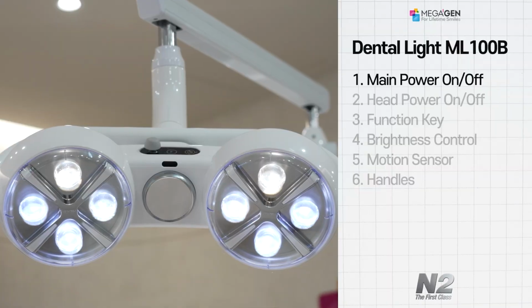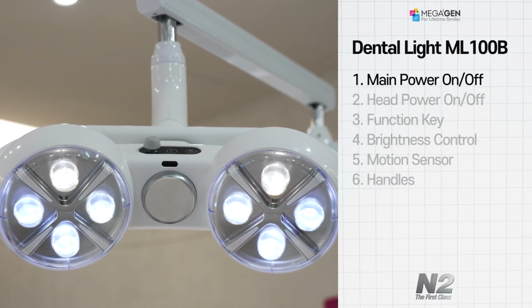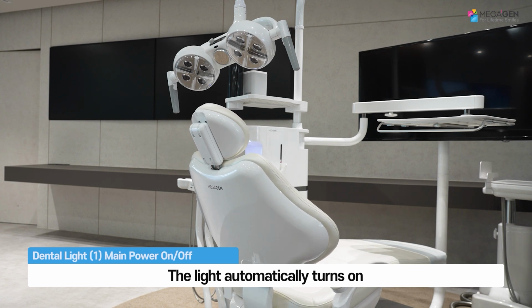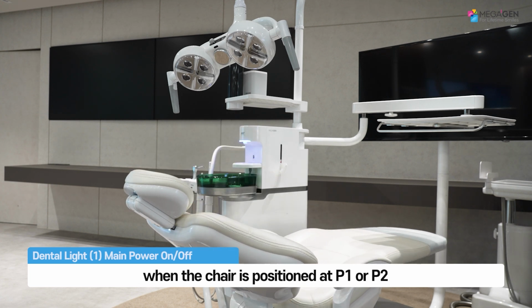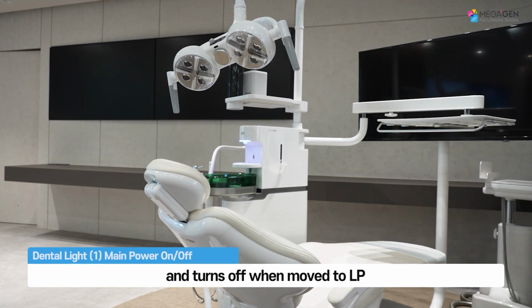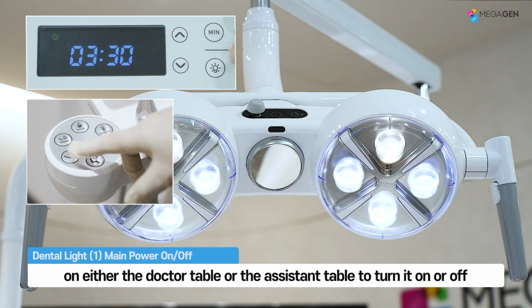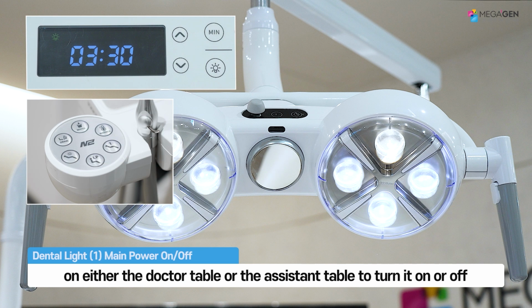How to use the dental light ML100B. To operate the light's main power from the chair, the light automatically turns on when the chair is positioned at P1 or P2 and turns off when moved to LP. Additionally, you can manually control the light by pressing the power button on either the doctor table or the assistant table to turn it on or off.